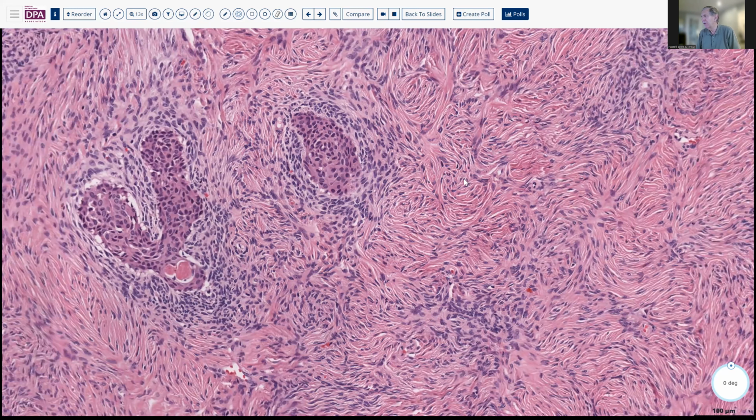So let's look at the other area that we have here, which is, as you can see, considerably more busy or more glandular and a fair bit more stroma associated with it. We still don't see a high degree of nuclear atypia, and the stroma itself doesn't look particularly atypical. But in areas like this, we're certainly seeing an increased proportion of glands relative to stroma. So it's beginning to look like there's some degree of proliferation associated with this.